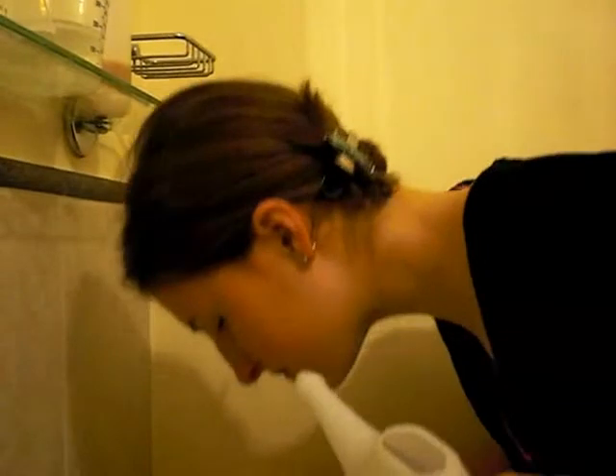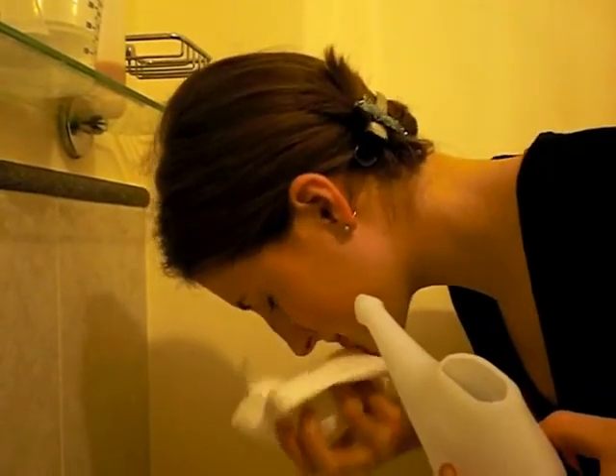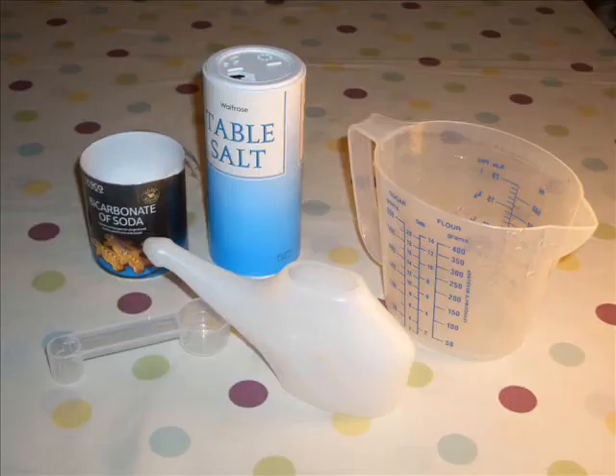If needed, adjust your head position by bending closer to the sink. Breathe normally through your mouth. When the pot is empty, forcefully exhale through both nostrils.